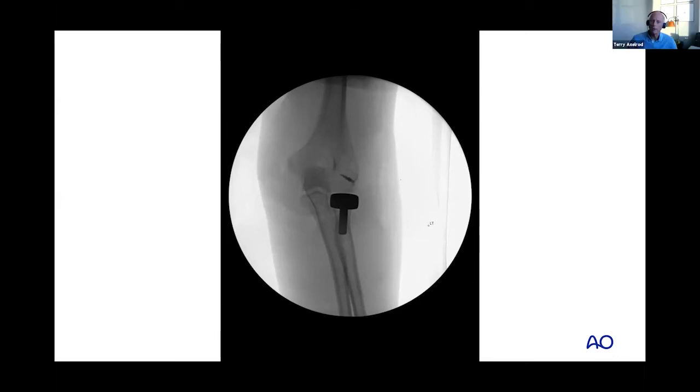That's good advice. Yeah, about this incision thing, I don't want to harp on it for too long, but when I used to do it with the universal posterior, I did it a couple of times and then I stopped. These really long incisions with huge flaps just seemed awkward and silly. Whereas you can do a relatively short Kaplan or Kocher exposure, and you can do 95% of what you need through that much smaller incision right where you need to be.